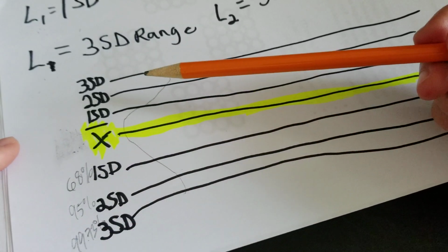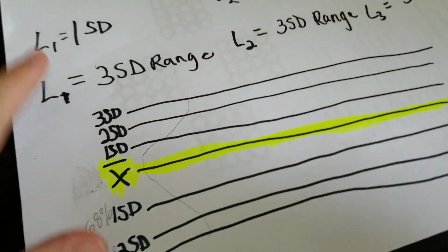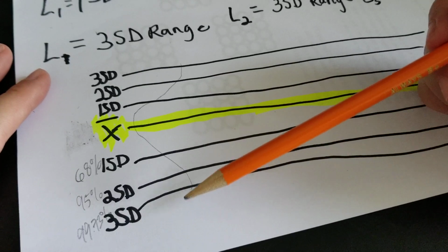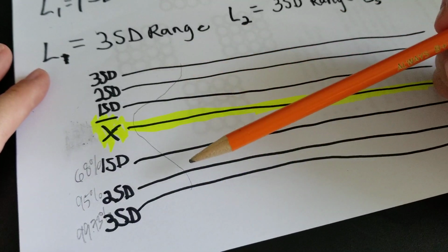The rest of the statistical analysis would say that you have a little bit, very few that go outside of the 3 SD range, and those would not necessarily be considered accurate.